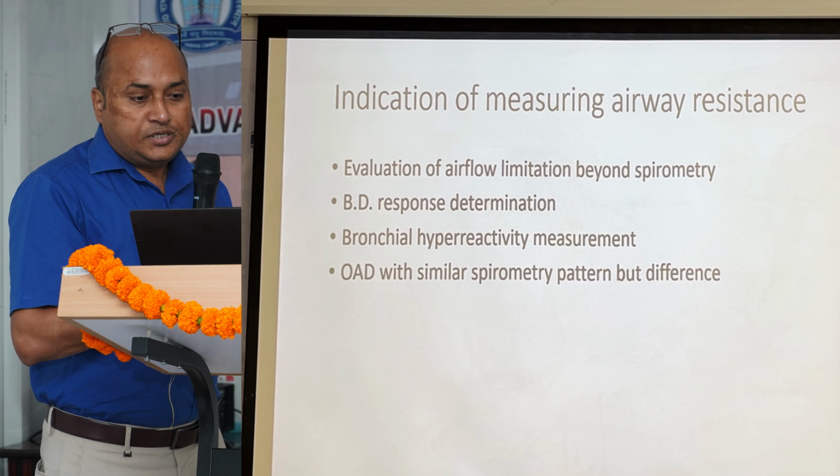Indications for measuring the airway resistance: evaluation of airflow limitation beyond spirometry. If the patient is not able to perform spirometry or has poor effort, then we can go by measuring the airway resistance. Bronchodilation testing, bronchial air.